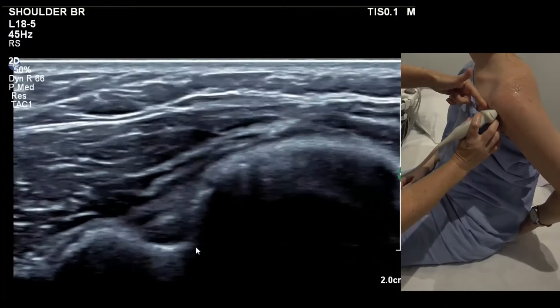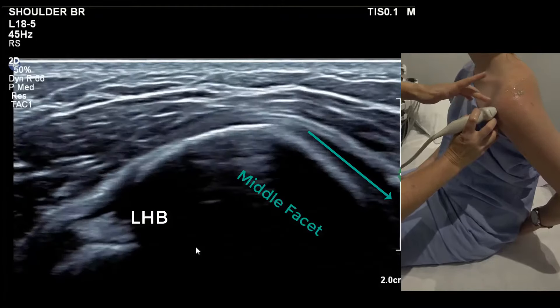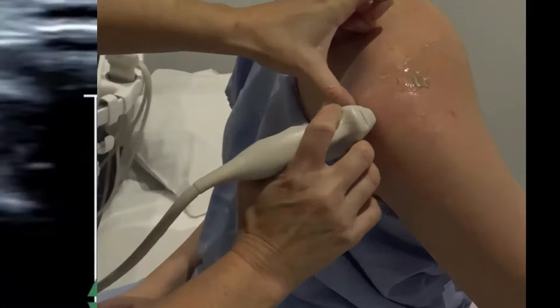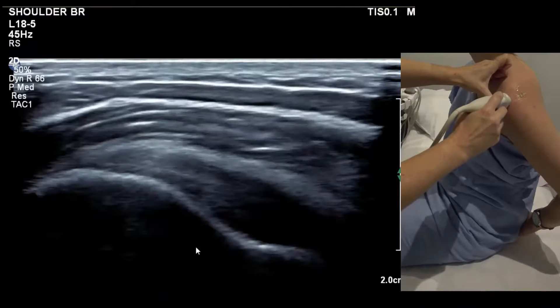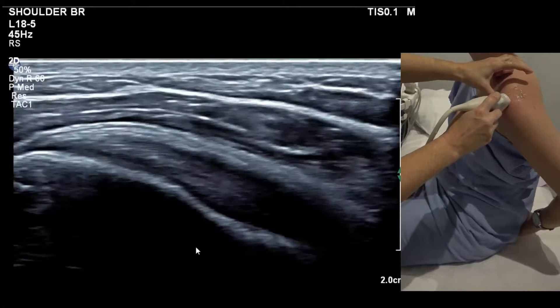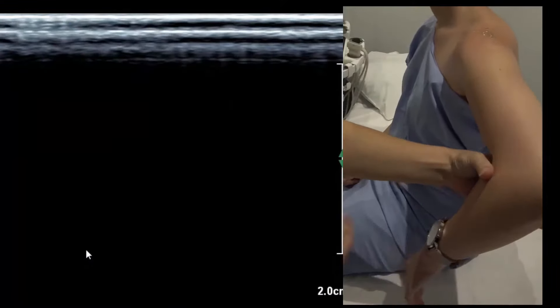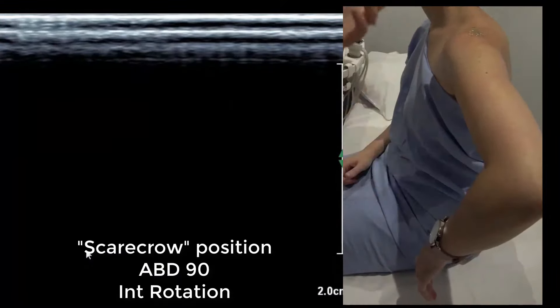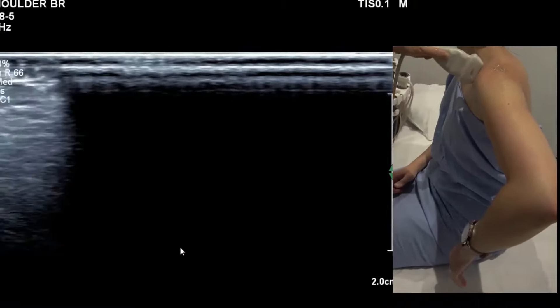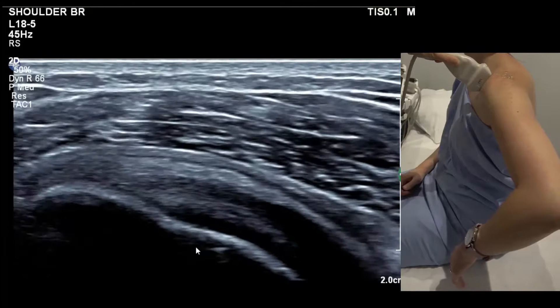You can see how far the biceps has rotated medially — there's the supra facet and the middle facet with the change in bone angle. That point on the patient's skin is where infraspinatus starts. Internal rotation of the arm brings the infra around really anterior. The same effect is achieved with the forearm dangling down — that's also internal rotation — and using the singlet view, landing straight on infraspinatus.